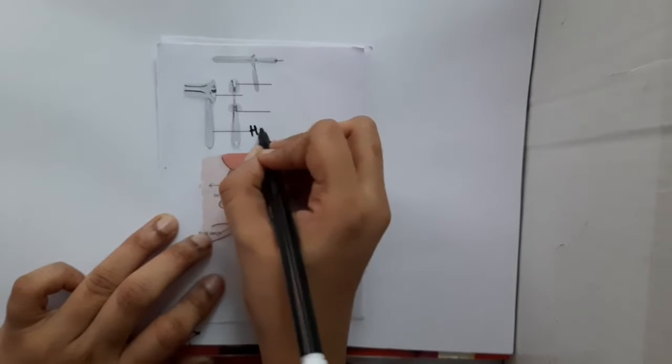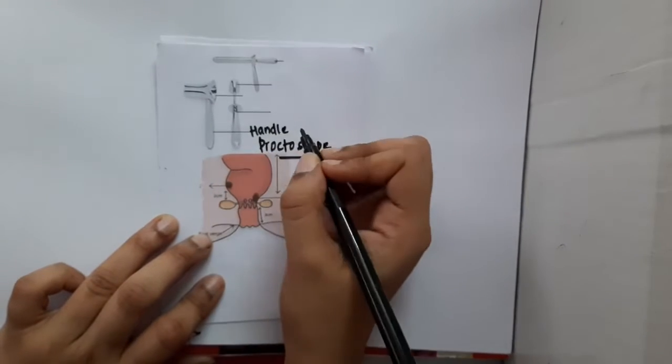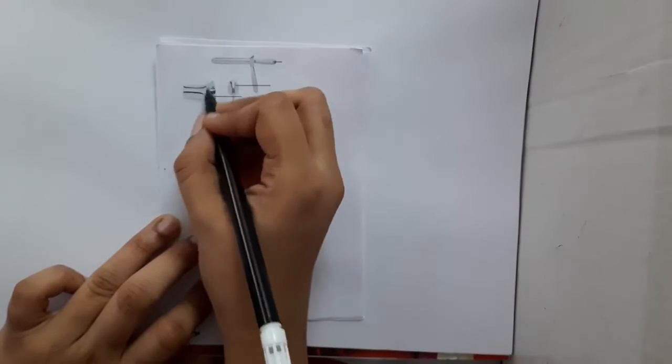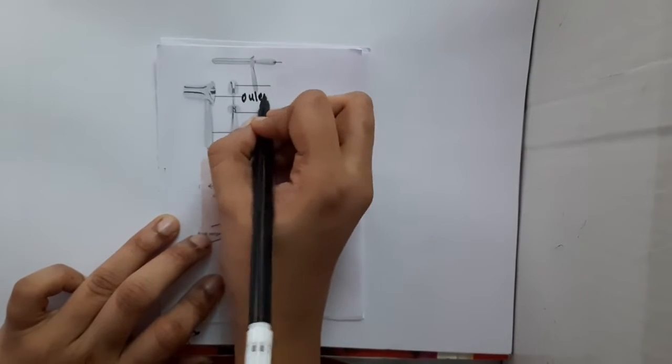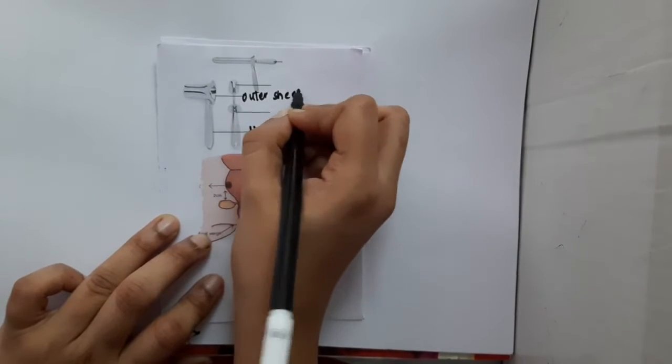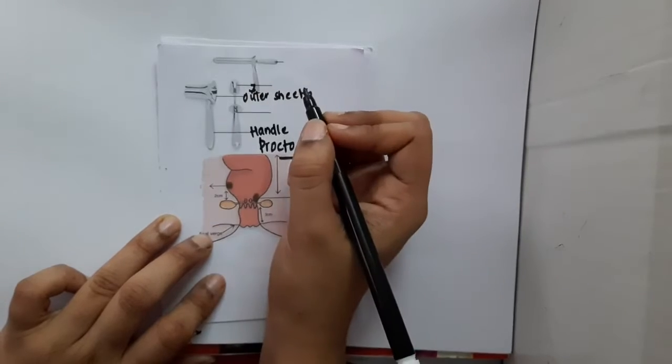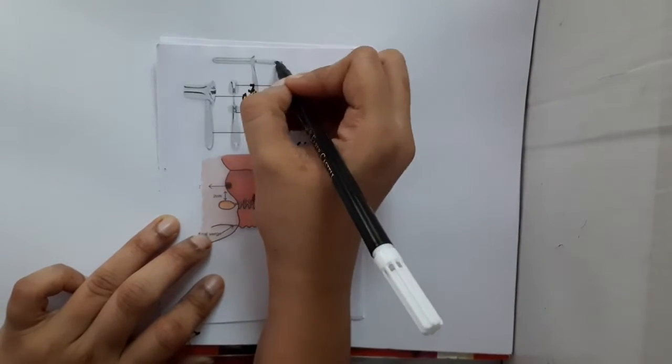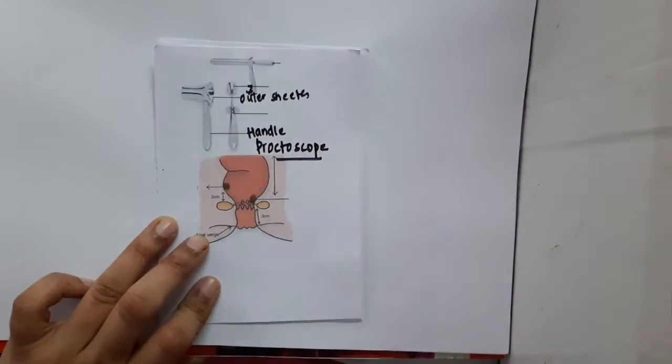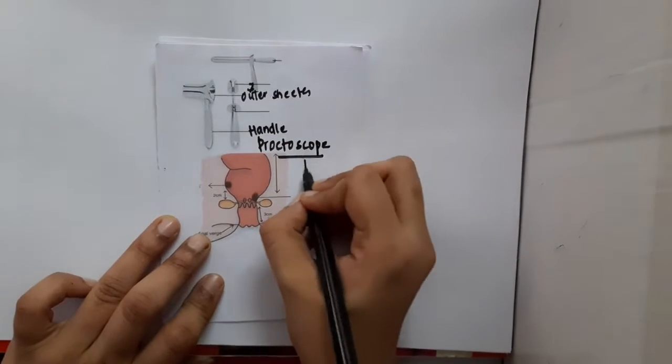See, this is the handle. This outer part is called the outer sheath, which is nothing but the outer sheet, and you will have this smooth and round part. Now, what is the length of the proctoscope?